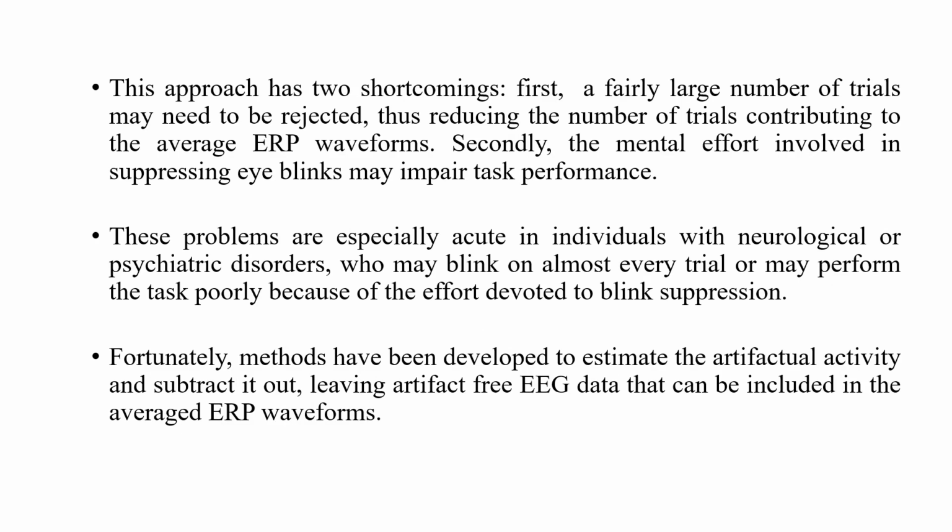This approach, however, has two shortcomings. First, a fairly large number of trials will need to be rejected because they contain these artifacts, and it reduces the number of trials contributing to the average ERP waveform.